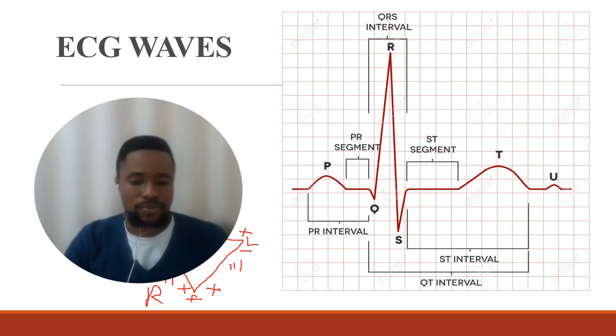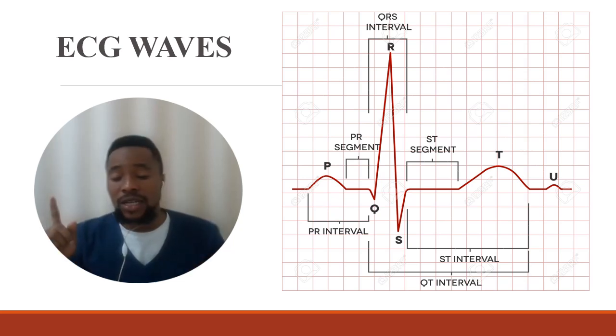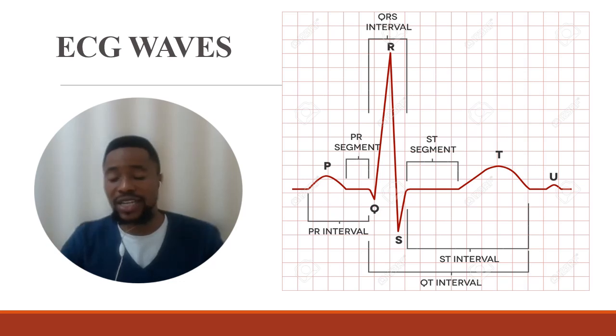Now, let me clean this off. I hope you understand that. Okay. So now, let's go back to what we are saying. Let me just quickly say something before I leave the leads. The ECG lead can also tell you information from the lateral wall, the inferior wall, the anterior wall. So quickly write this down.